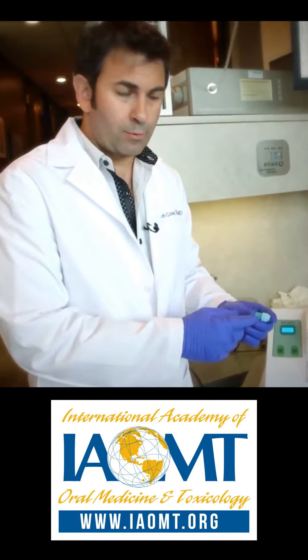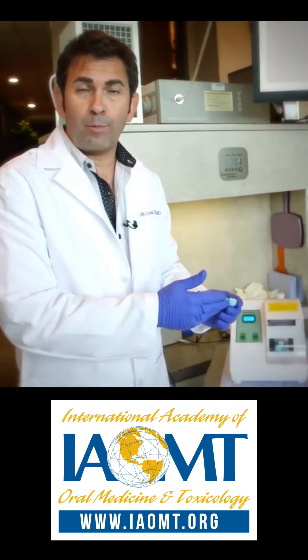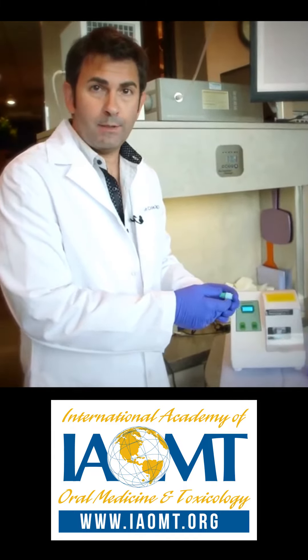Keep in mind that we're taught in dental school that once they combine, the mercury becomes relatively inert at that point. So let's try this.